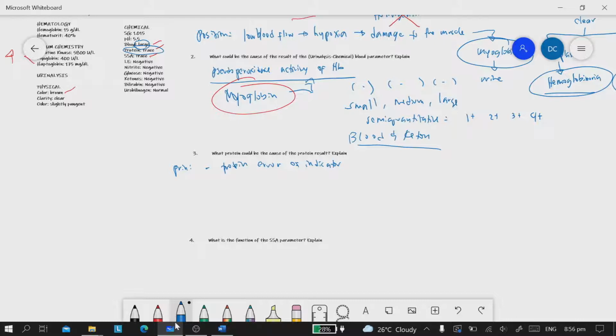So let us explain this briefly. Primarily the color of your pad is yellow, and then when this is added with your protein, which is in an acidic environment, that protein will take up the hydrogen content of the pad, and that hydrogen also is conjugated to a blue-green indicator. So that blue-green will appear if there is uptake of your hydrogen ion. Alright, so we already have the principle.